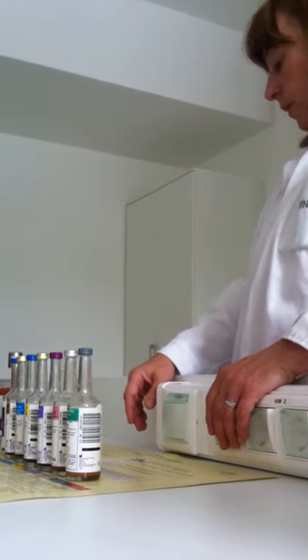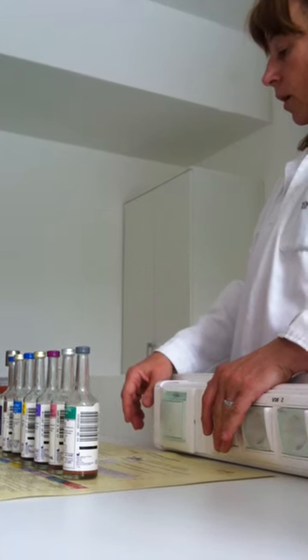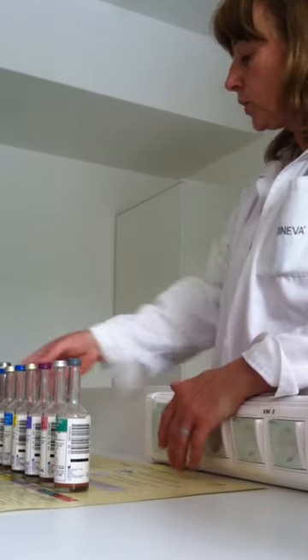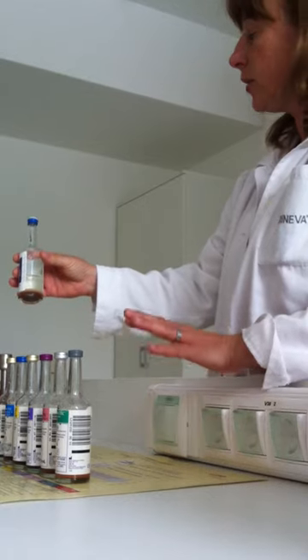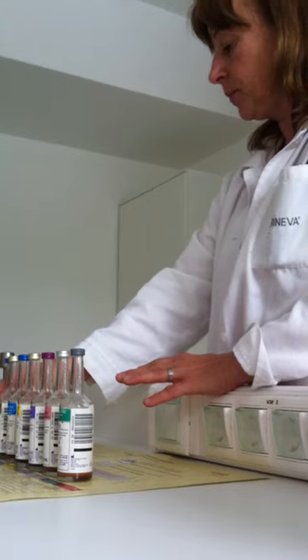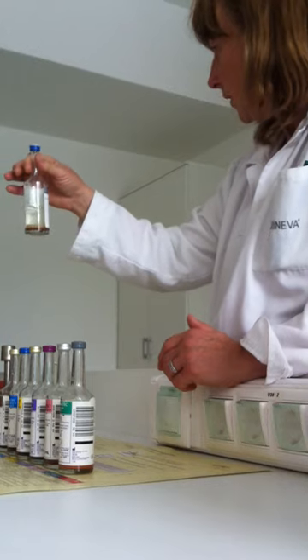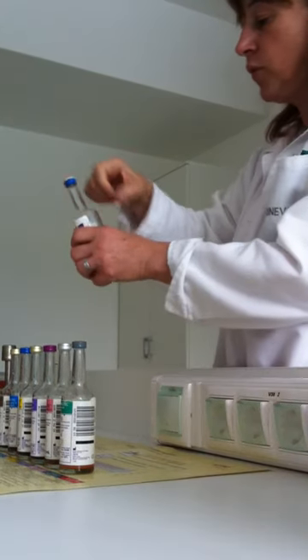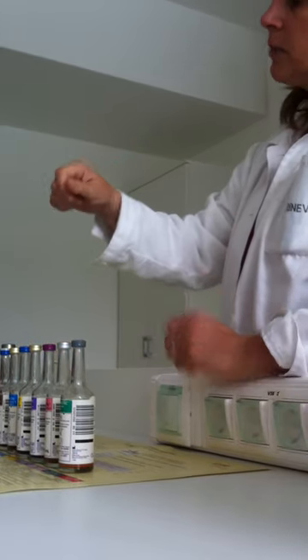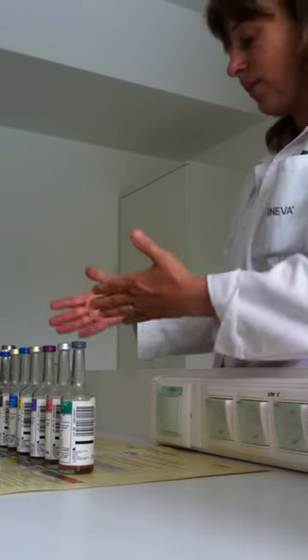Okay, but why do we want it to give us an alarm? Because it means there is a hematogenous bacterial infection. But for the bacteriological work, we will not check every bottle immediately, and this is not obvious. But if it becomes positive, we will remove a small amount, 1 milliliter, into a sterile tube, and from this we will make a slide, a stain preparation. We can see whether it is gram positive or gram negative.